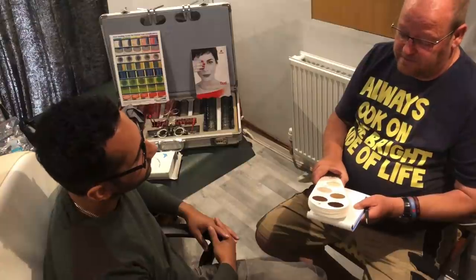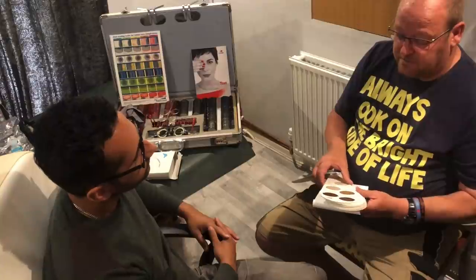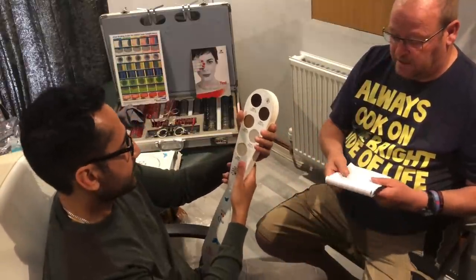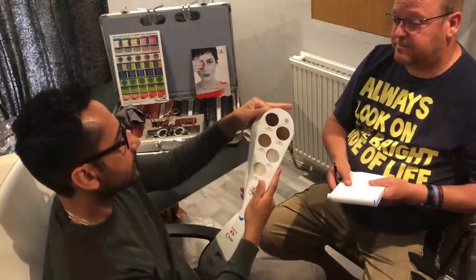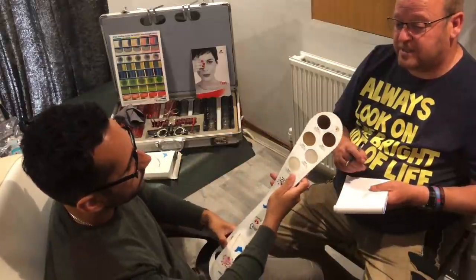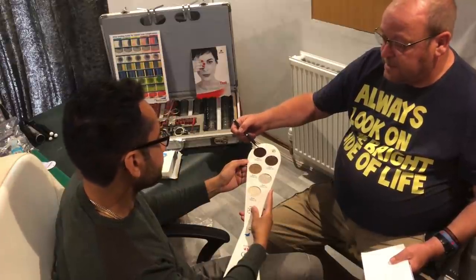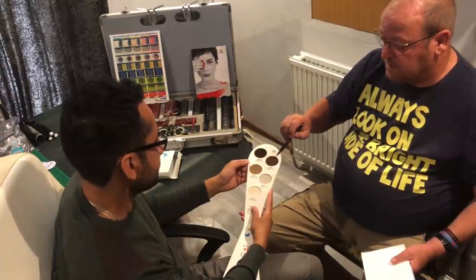Now the whole point of that is that everybody wants them done differently. So if I just hold these up to show you — the darker the colour, the lower the light transmission. And as we go through with the brown lenses, we can see that's very dark. Now I wouldn't recommend wearing this darker lens for driving. So this would be the darkest I would recommend for driving.